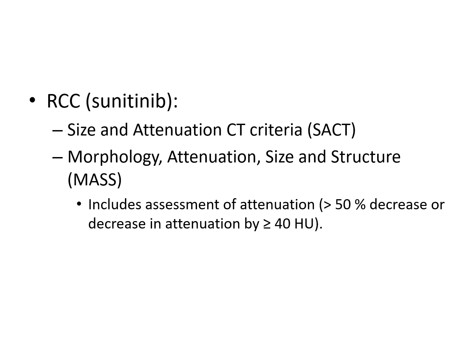RCC, again, also has another criteria, which looks at the attenuation. So it's similar to the Choi criteria, and this is for sunitinib. And again, you look at the size as well as the attenuation, and that helps you.